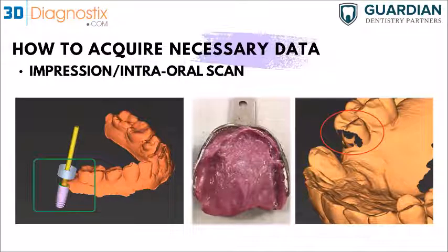Another thing is if the sleeve is too close to this part of the tooth, we're not going to be able to judge whether it's going to be hitting it or not. So again, move slowly while recording or taking the images, just to make sure that we don't have any problems with the stitching of those images together.